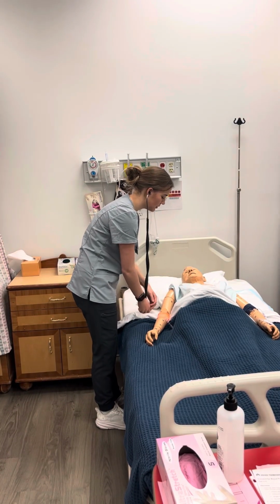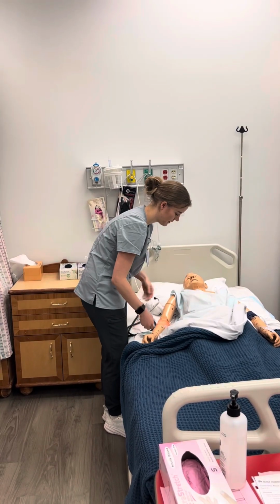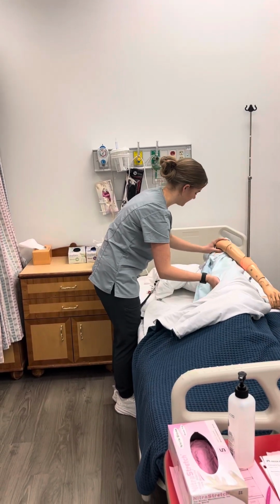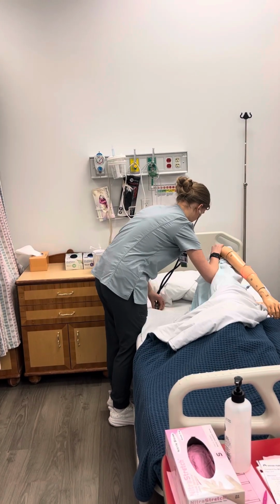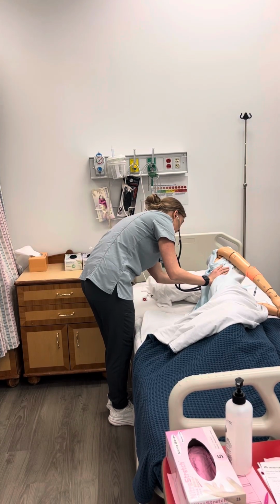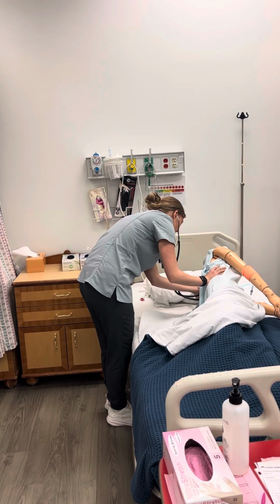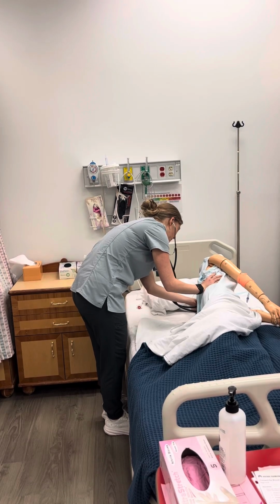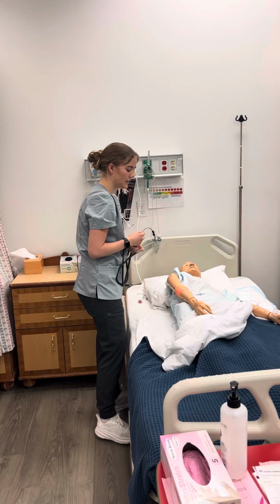Okay, now I'm gonna listen to your lungs on the back side, so I'm gonna have you roll over for me. Back here. Help assist you rolling over. Okay, go ahead and take a deep breath for me. Deep breath again. Deep breath. Another one. Another one. And one more. Okay, perfect. Those all sound great.